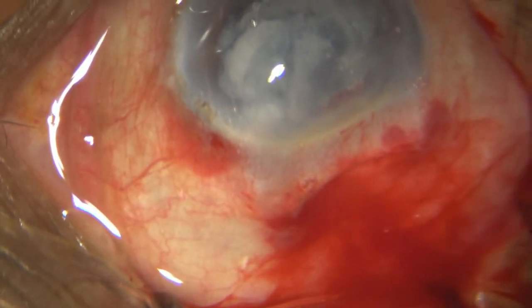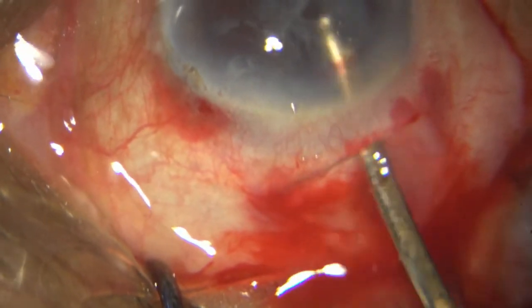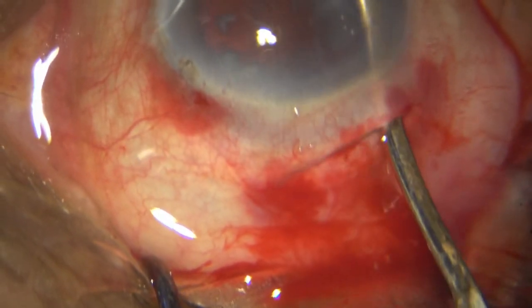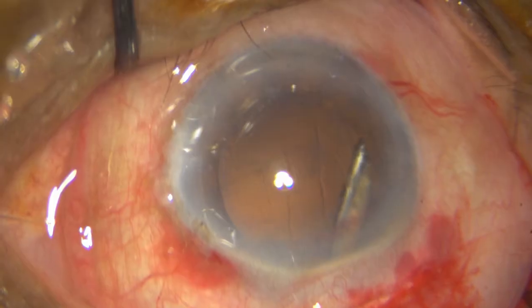Most of the cortex comes out with hydro expression. I take my Simcoe and remove the rest of the cortex. You can use the side port as well to take out the sub-incisional cortex.